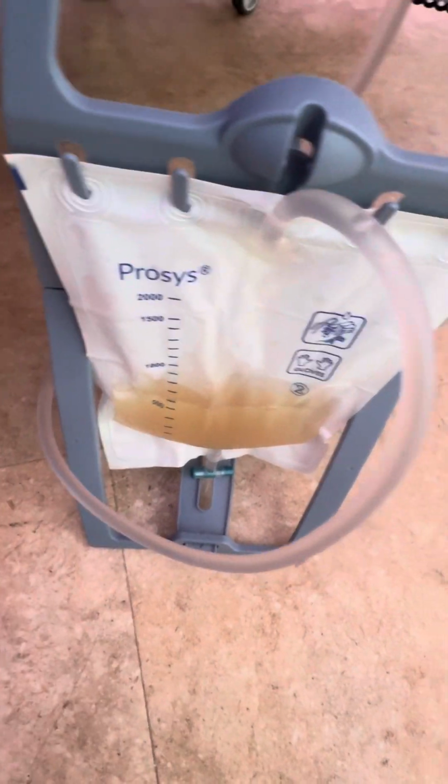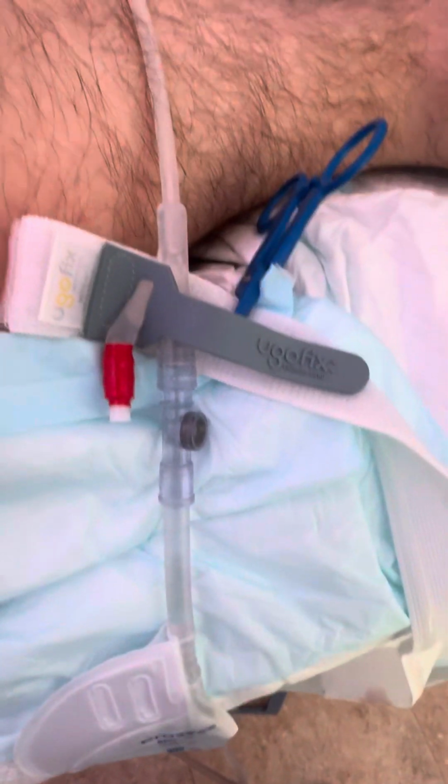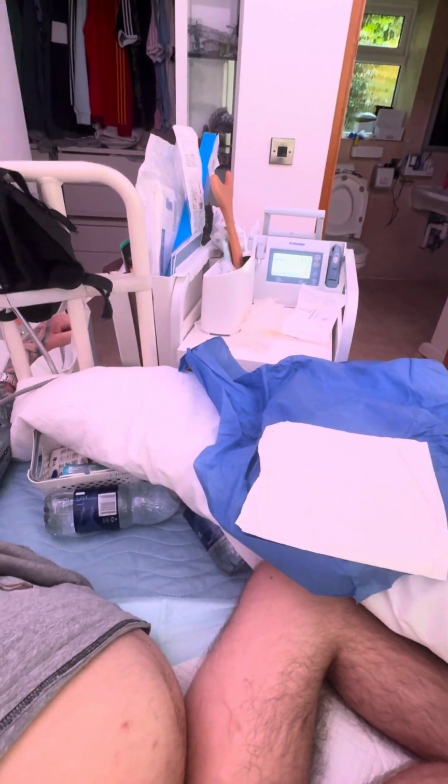And in the night bag, we've still got 500, or just over, I'd say 600 there. But obviously all the way up is a flow, is urine. All the way to the end, to the stoma, I've got urine. And I haven't got any gloves right now to touch that tubing, but I will make sure it's warm. So I will do another reading now, and you're going to go on your vent, aren't you?